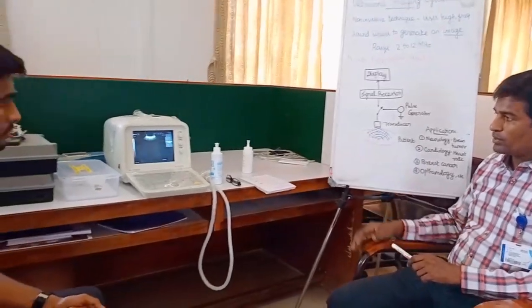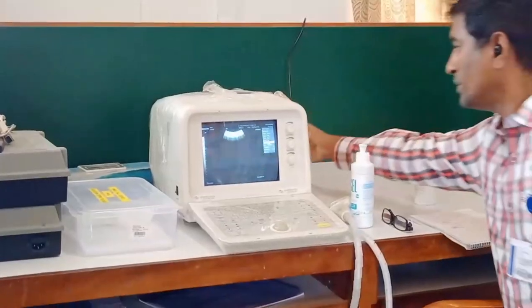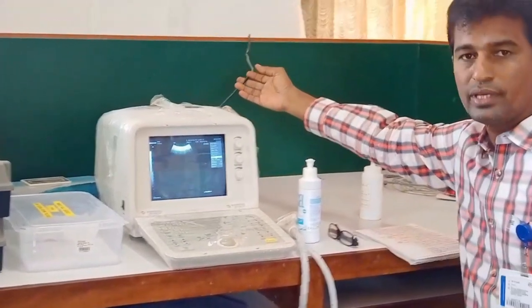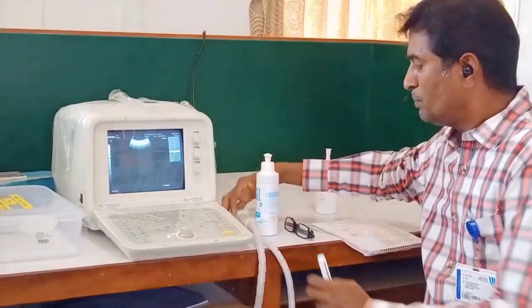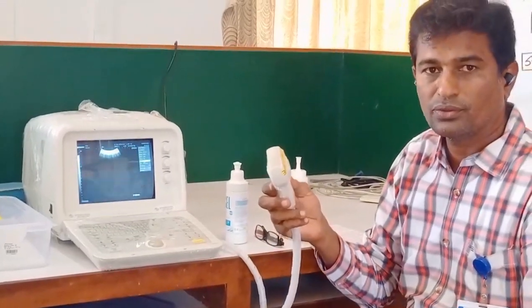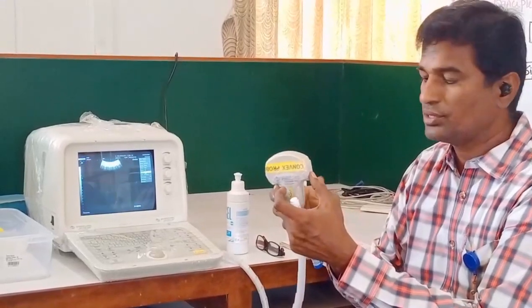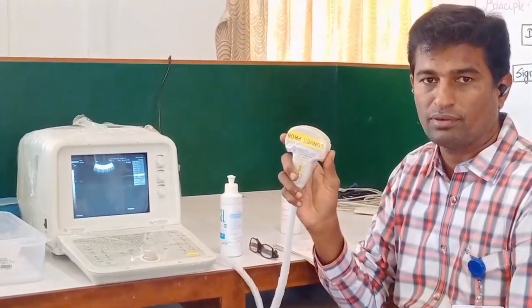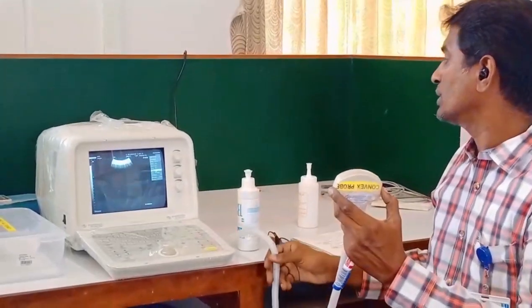Now we will move on to the demonstration of how to acquire ultrasound images, and this is powered by a 230 volt 50 Hz single phase supply. And here this is the probe, and there are three different types of probes. Here we are using the convex probe, and there will be a notch which we should hold at the left end of our hand, and this is connected through this cable.